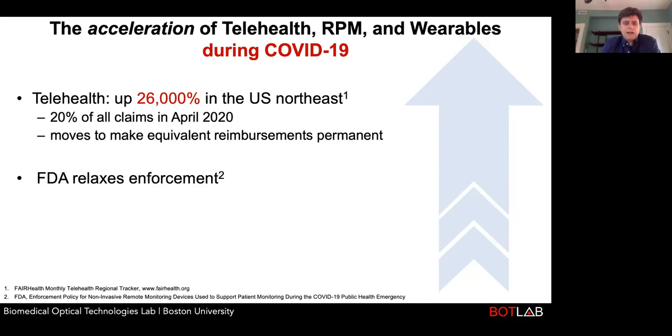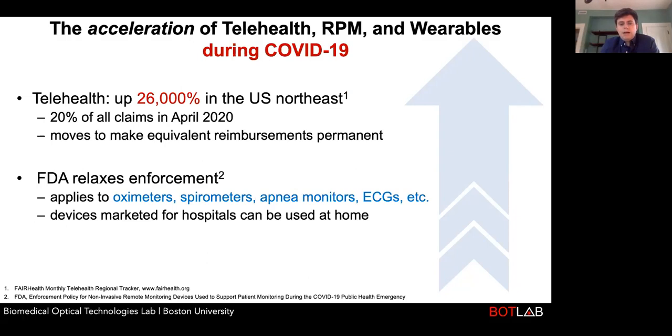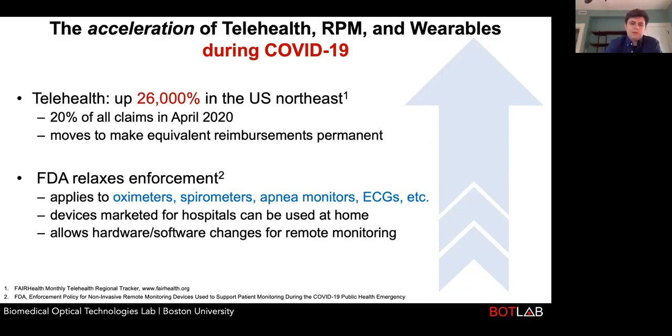Our Federal Drug Administration has relaxed some enforcement on devices like the ones you've seen here to make it easier for people to use these devices at home. So even if they've been marketed in hospitals, you can now use them from home, at least during the pandemic.